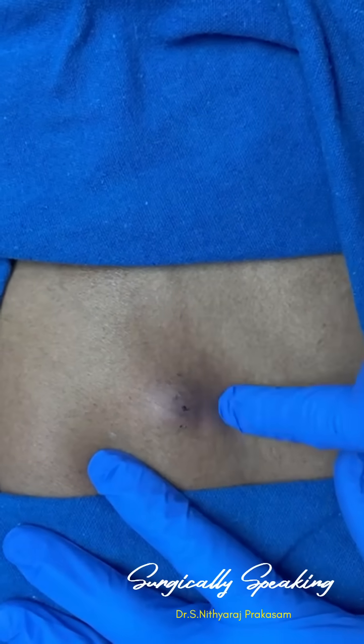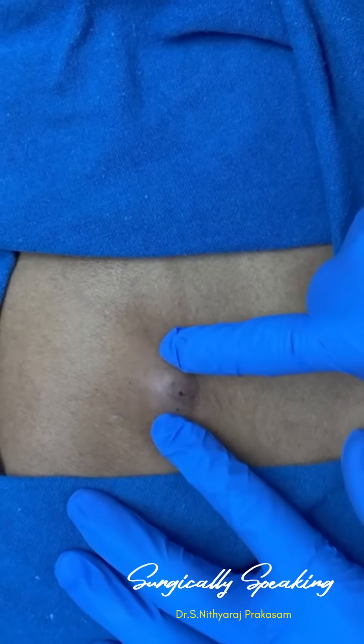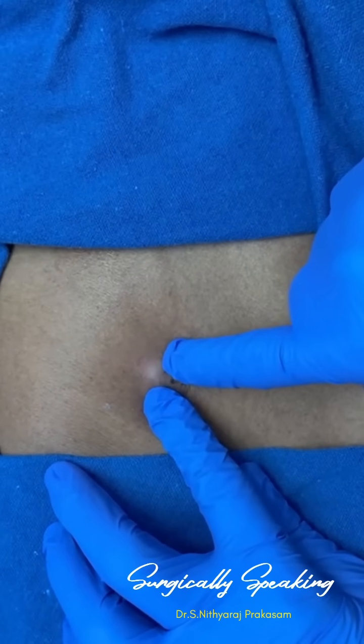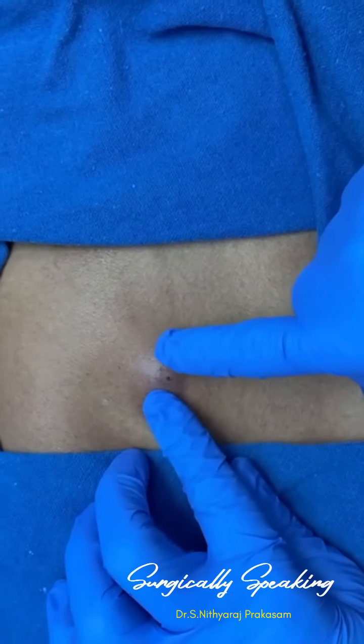Okay, so this is a sebaceous cyst in the back region. This patient had it for almost 12 years, that is what she says. But she didn't bother about it because it was not causing any pain. But over the past 3 days, it has become painful, and the swelling has also increased in size. When I do this, see there is fluctuation, and you may see a punctum there. So now it is an infected sebaceous cyst.